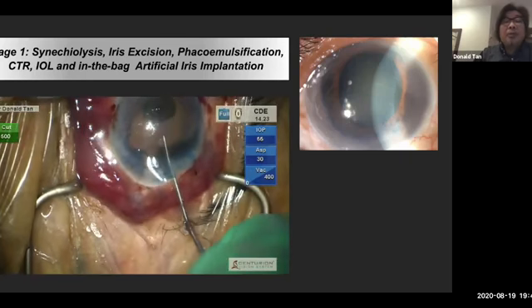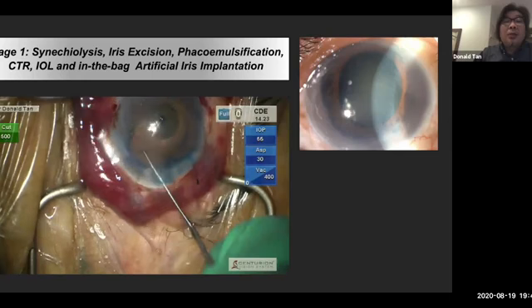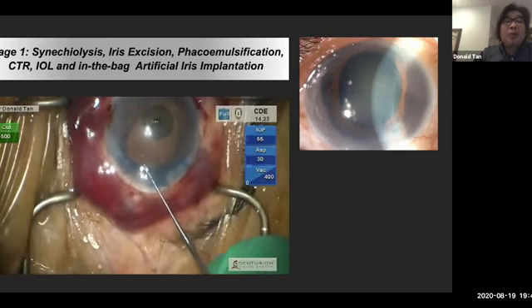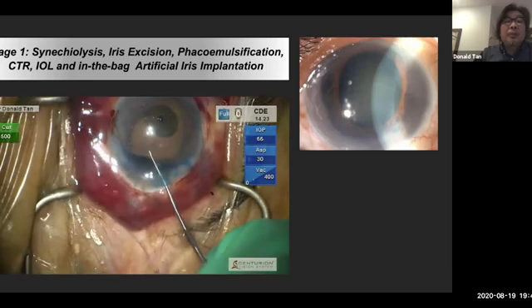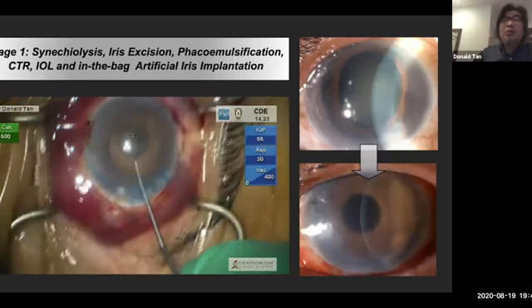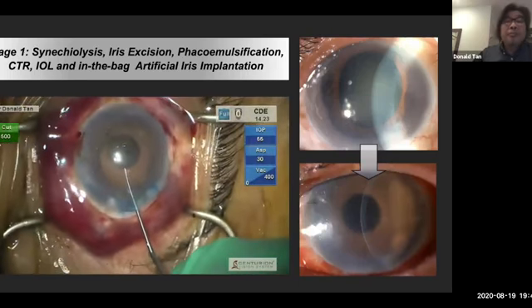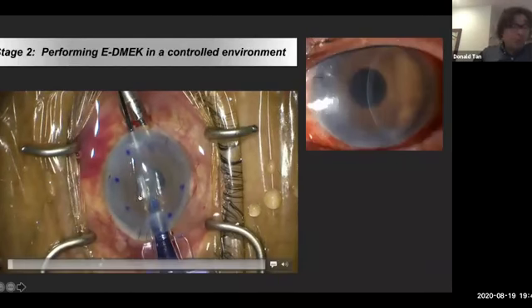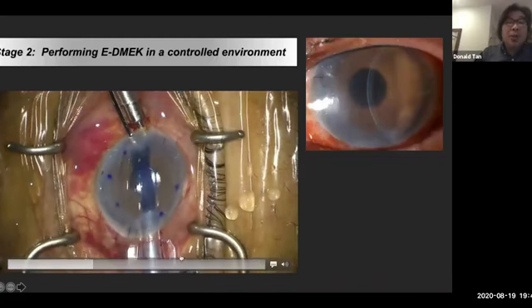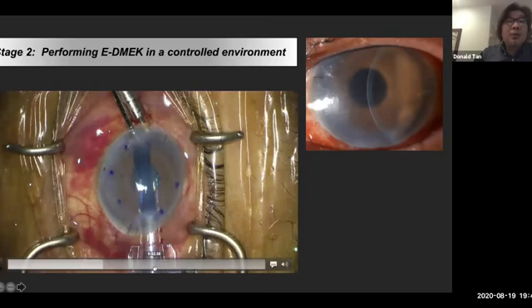Just take your time, get the edges folded in. And once it goes in, then you'll see that it's pretty straightforward. Almost there, the center there. Okay, so this is what it looked like post-op. And then I'm going to skip through. I think we're running a bit short of time, but basically we're talking about the same procedure. Really not much difference here.